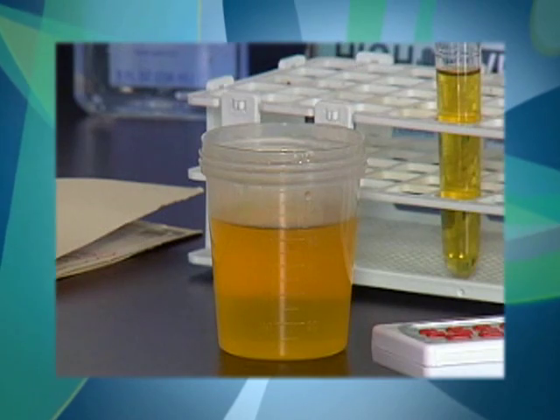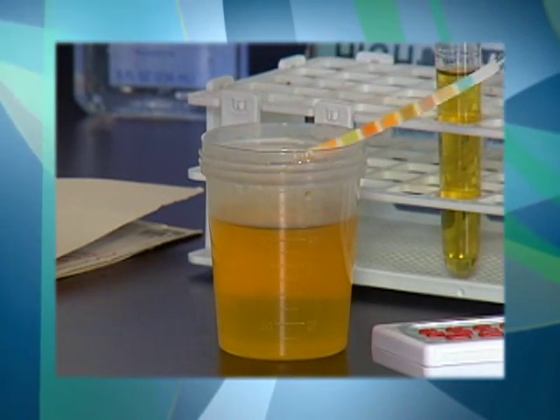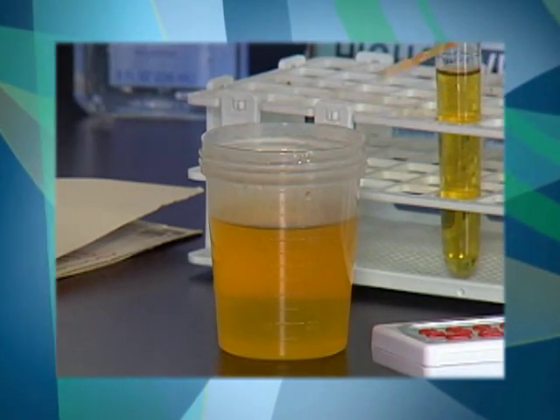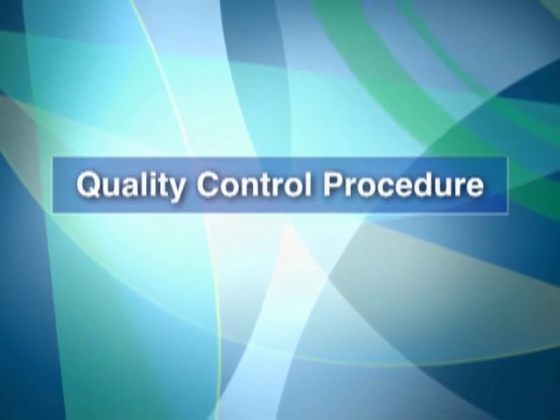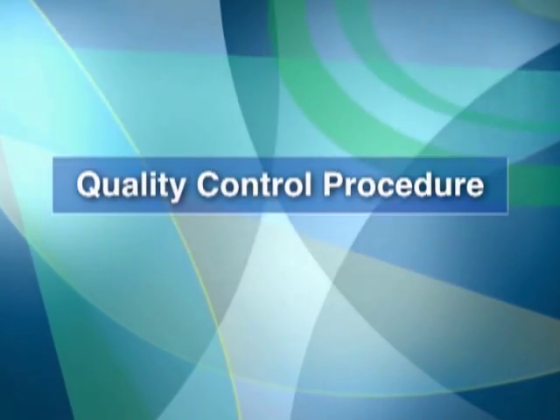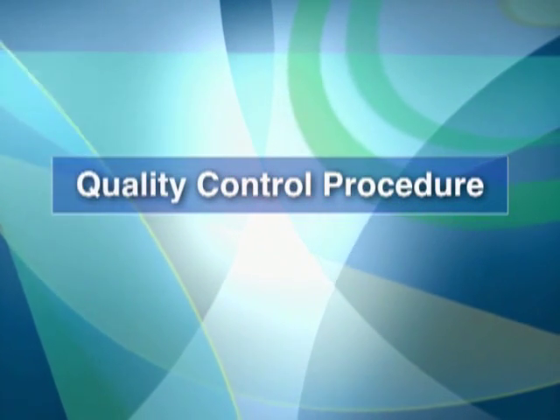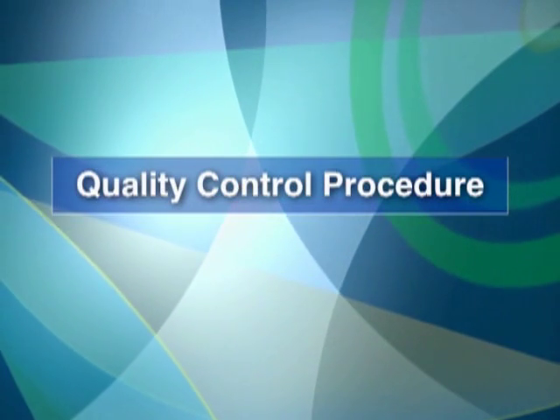The medical assistant will show you how to perform a physical assessment of a urine specimen and a chemical assessment using a Multistix 10 SG reagent strip. To check the reliability of the Multistix reagent strips, a quality control procedure should be performed each time a new container of test strips is opened, or when there is a question of reliability regarding the testing strips.